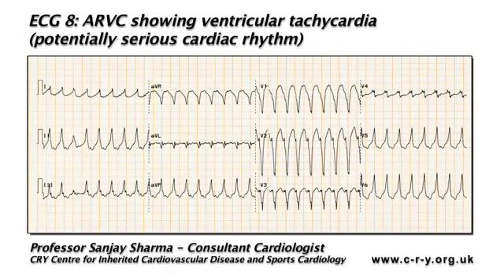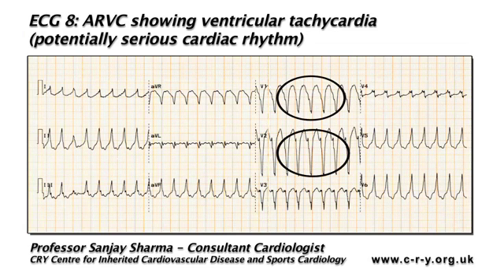This slide shows evidence of a broad complex tachycardia. A broad complex tachycardia should always be regarded as ventricular tachycardia until proven otherwise. Some of you will appreciate that this tachycardia has very negative complexes in V1 and V2, suggesting that it has a left bundle branch block morphology.